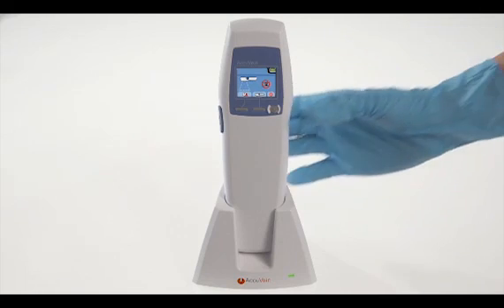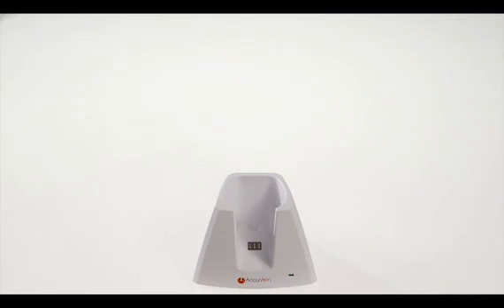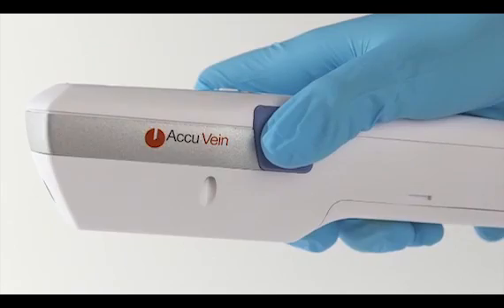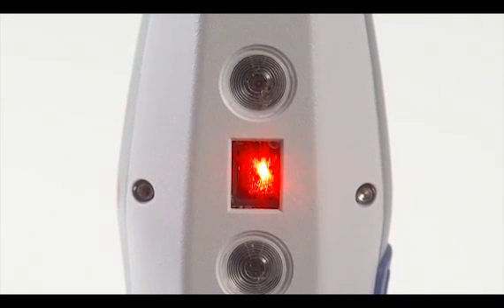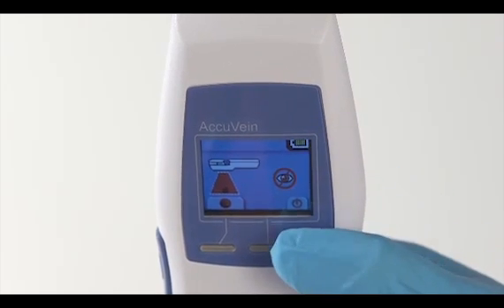To use the AccuVein AV400, remove it from the charging cradle. To turn on the vein light, press the blue button found on the left side of the device. To turn off the device, press the circular button on the top.